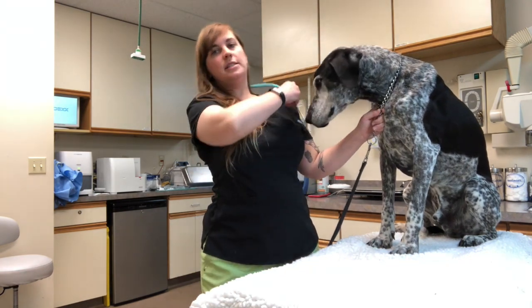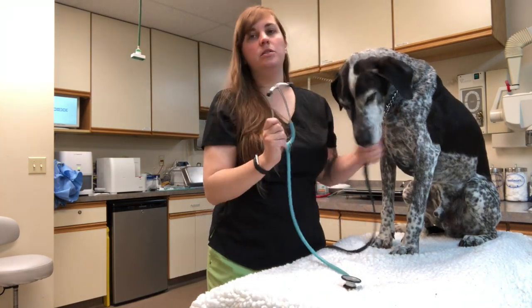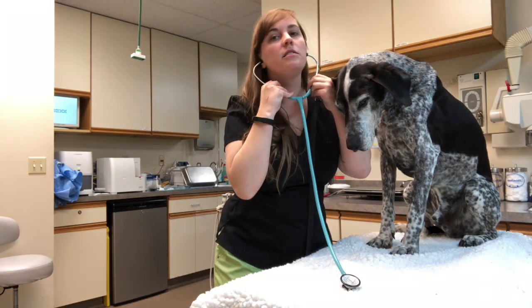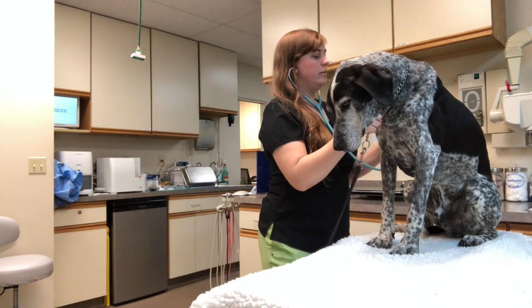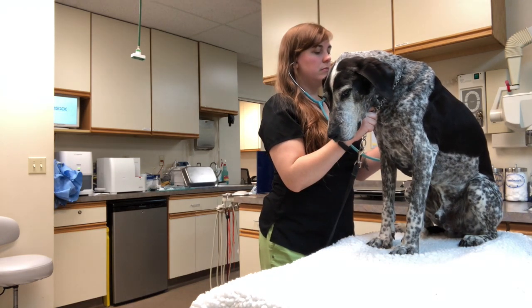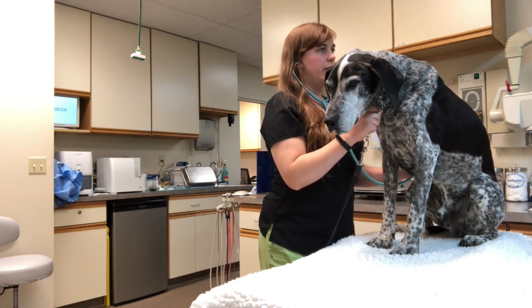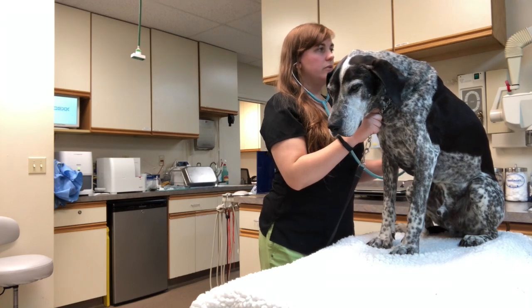So to start, we're going to listen to Austin's lungs. With the lungs, you want to listen to 9 quadrants on both sides of the chest, so we're going to listen to all 9. I'm going to listen for those crackles or wheezes. Ideally, you want to listen to each quadrant for a cycle of 2 breaths.